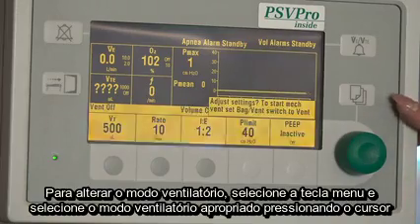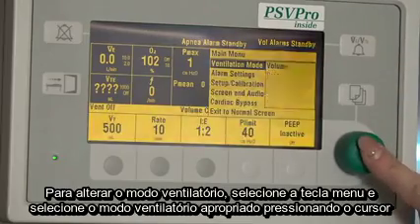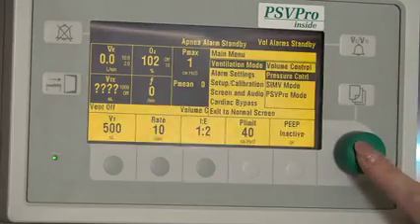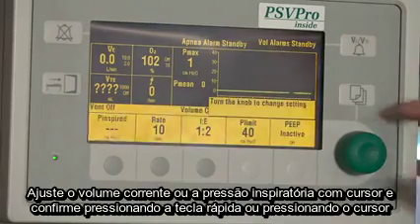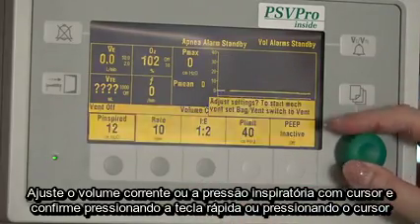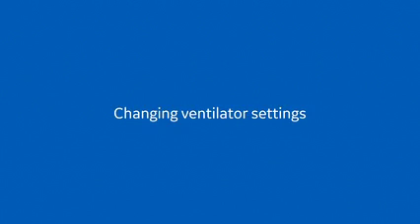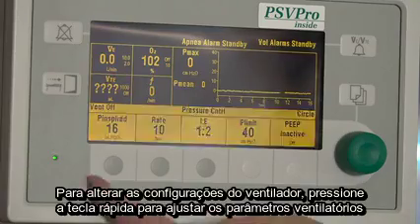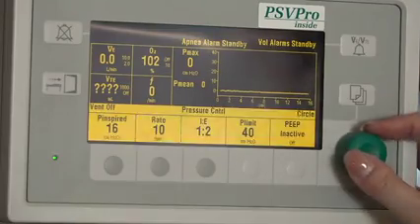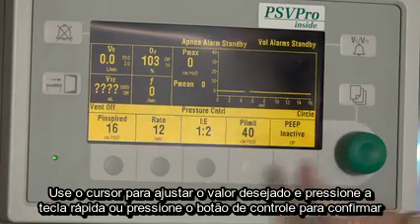To change the vent mode, select the Menu key and select the appropriate ventilation mode by pressing in the comm wheel. Set the tidal volume or inspiratory pressure using the comm wheel and confirm by pressing the hard key or by pressing in the comm wheel. To change ventilator settings, press the hard key for the ventilation setting to be adjusted. Use the comm wheel to adjust the desired value and press the hard key or press in the comm wheel to confirm.